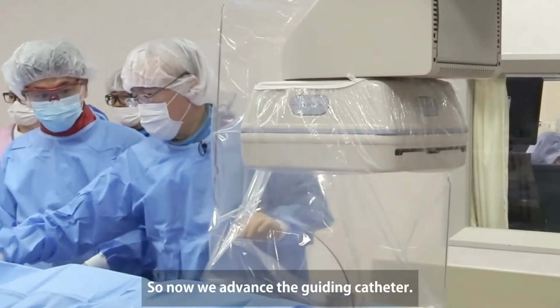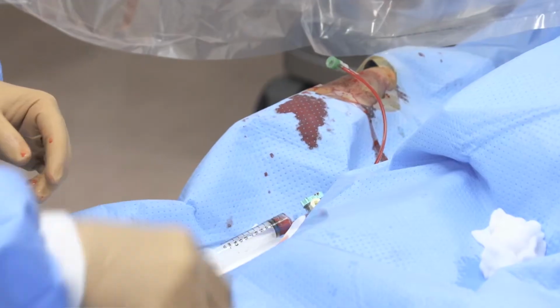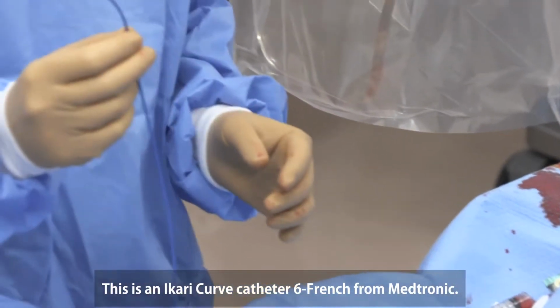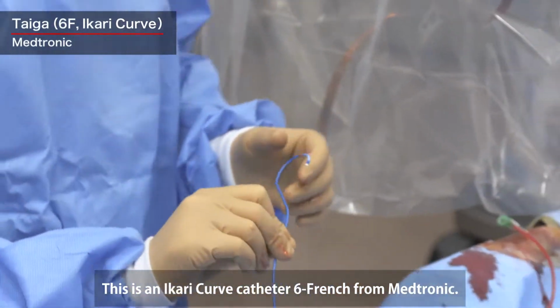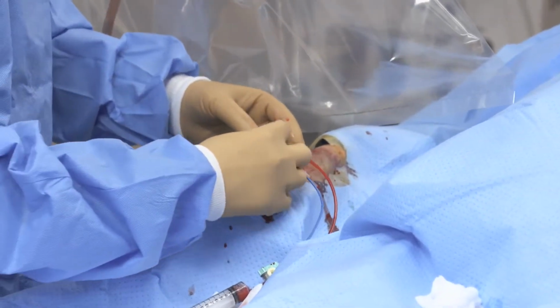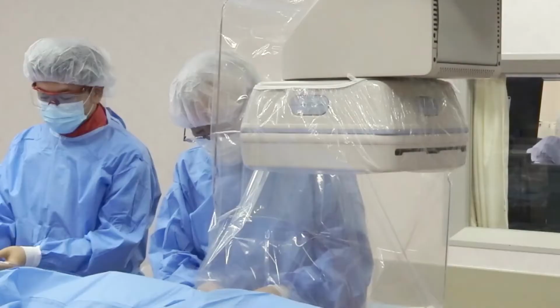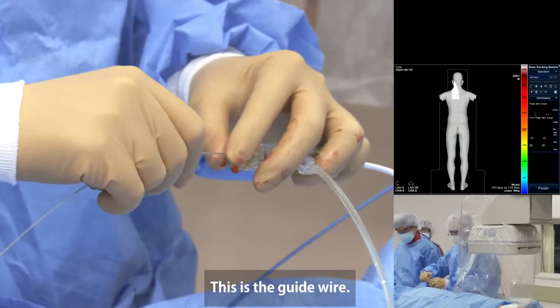So now we advance the guiding catheter. This is an Ikari curve catheter, 6 French from Medtronic. This is the guide wire.